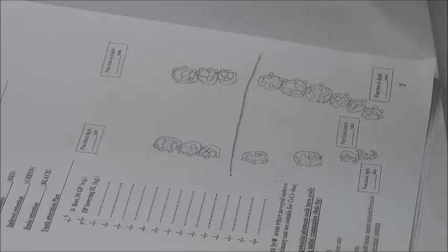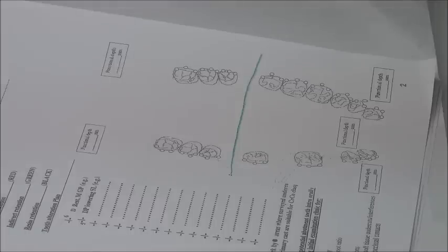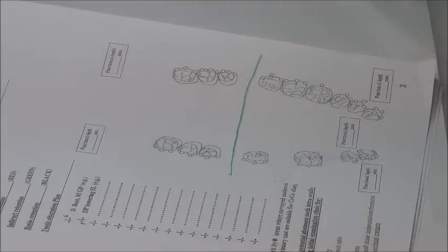What else do I do when I do cross arch stabilization? What do I get more? I get more retention. And this is part of when they talk about equalizing retentions on both sides. When we said that we need two clasps on one side, we should have two clasps on the other. I could place one clasp on the canine that is already part of an abutment and one clasp here, or even better, remove the clasp on the canine and put double Akers on the posterior. Okay, so I'm also sending retention to get retention.